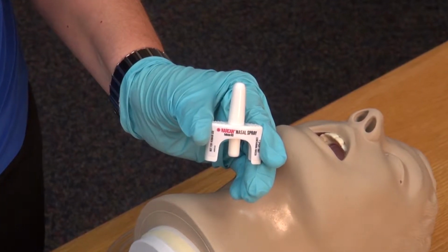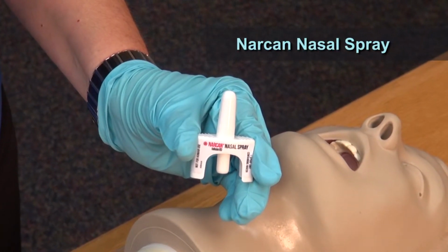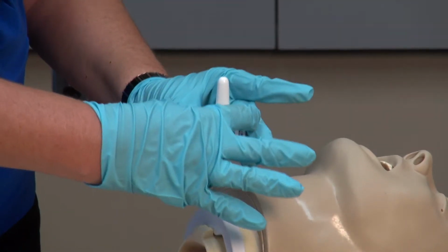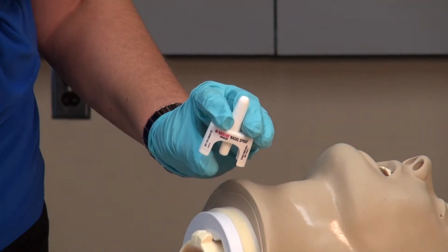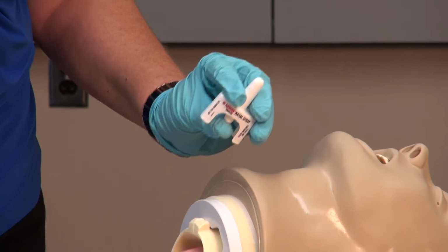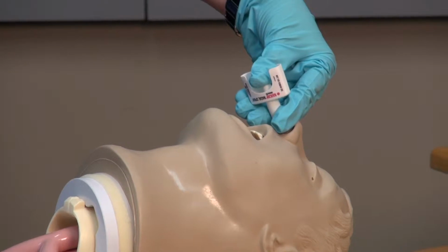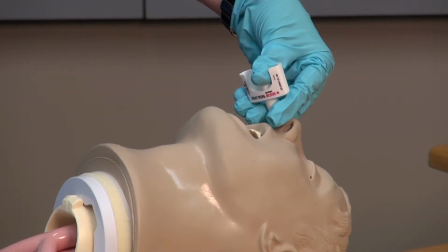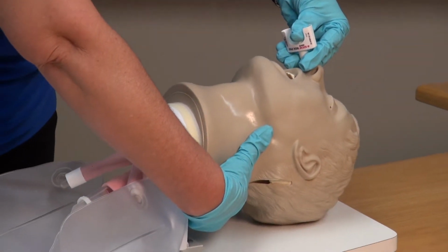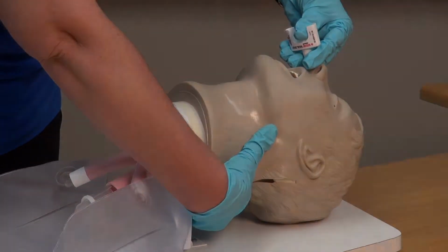Finally, the newest intranasal formulation is a device that requires no measurement or assembly. This is the Narcan nasal spray. There is a very small volume of liquid in this formulation, so just select one nostril and squirt the entire amount by holding the device with your 2nd and 3rd fingers around the nosepiece and your thumb on the plunger below. Insert into the nostril just until the tops of your fingers touch the bottom of the person's nose. Then push up with your thumb. It is recommended to have your other hand supporting the person's neck and tilting their head back to ensure that none of the medication rolls out.